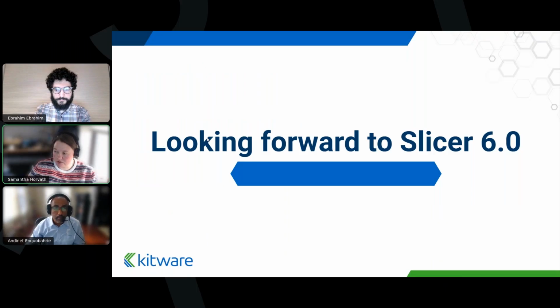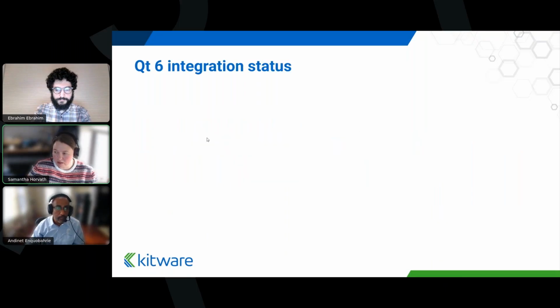So looking forward to Slicer 6.0. The big thing that we want for Slicer 6 is Qt6.